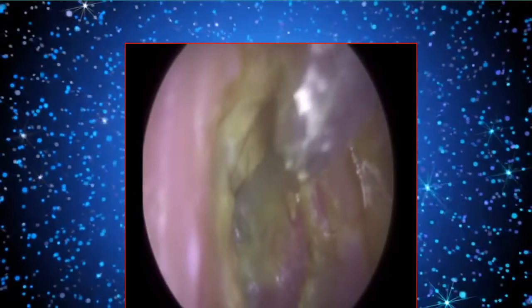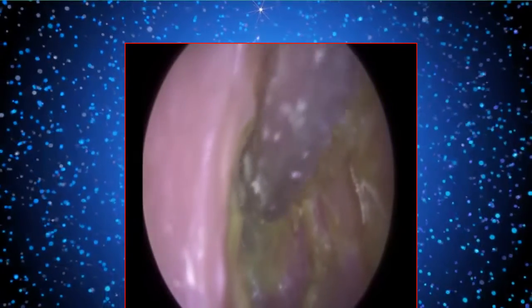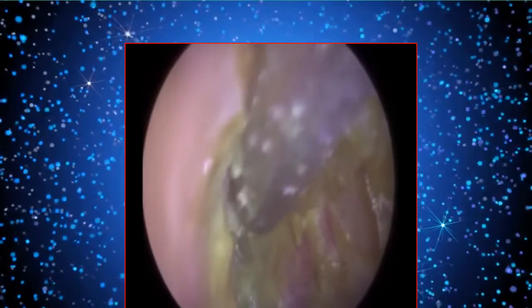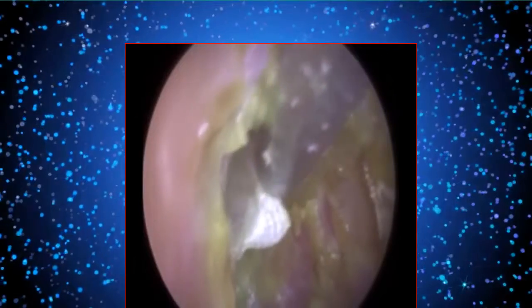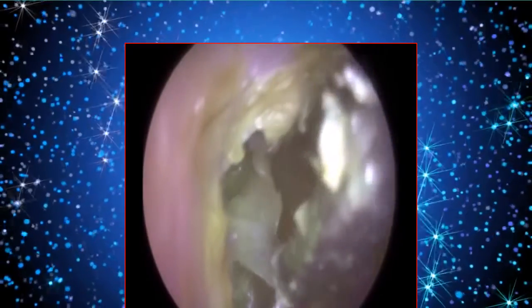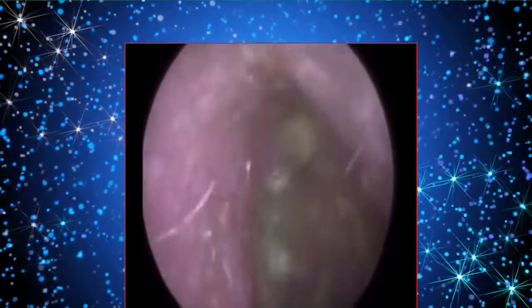Again, after I finished the procedure, I performed tympanometry, and the patient also had glue ear on this side. So unfortunately, he's got an outer ear infection, which is the otitis externa, which is the infected debris in the left ear canal, and the swelling and the infected dead skin on the right side. So that's the outer ear infection, otitis externa, but he's also got a middle ear infection called glue ear.